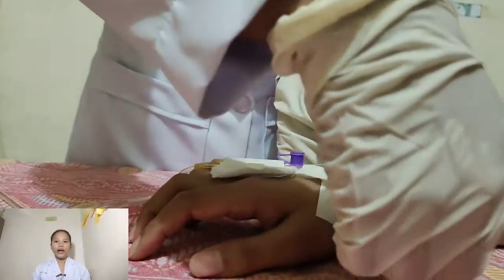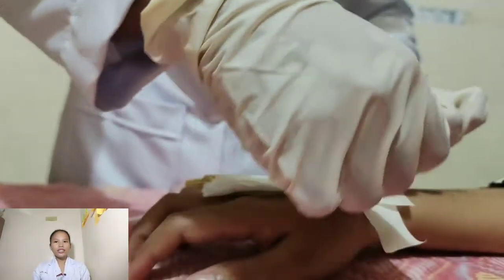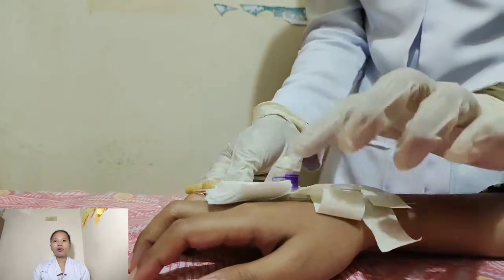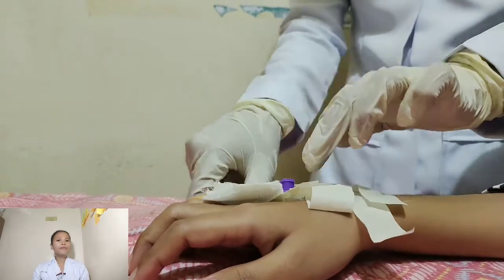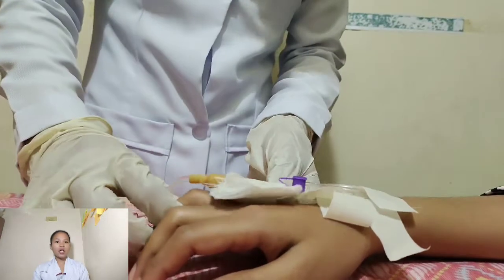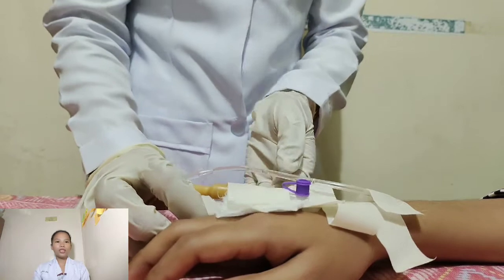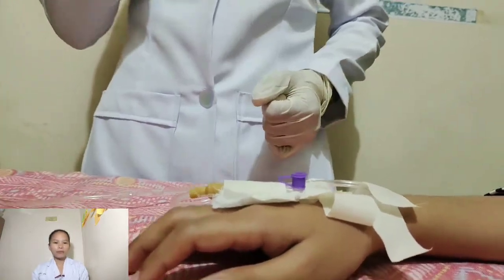Release anchorage of arm, tubing, and needle. Loosen the tape of the venipuncture site while holding the needle firmly and applying counter-traction to the skin. Movement of the needle can injure the vein and cause discomfort to the client. Counter-traction prevents pulling the skin that causes discomfort.